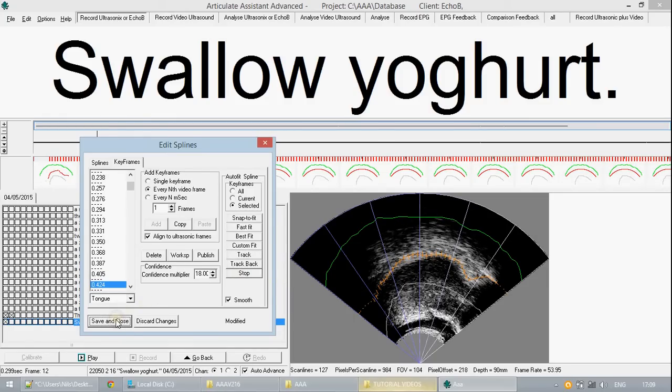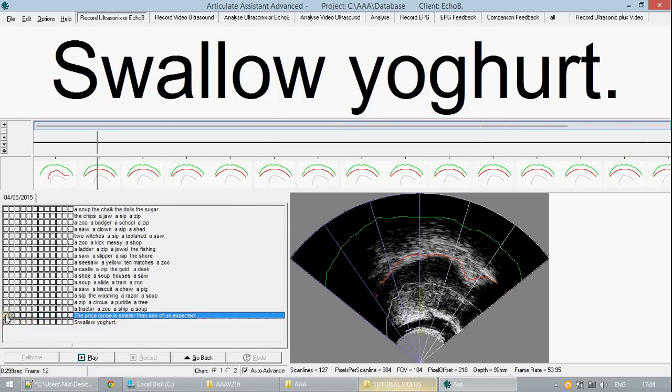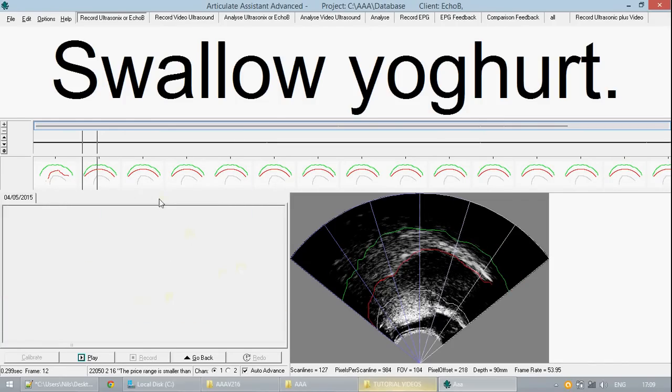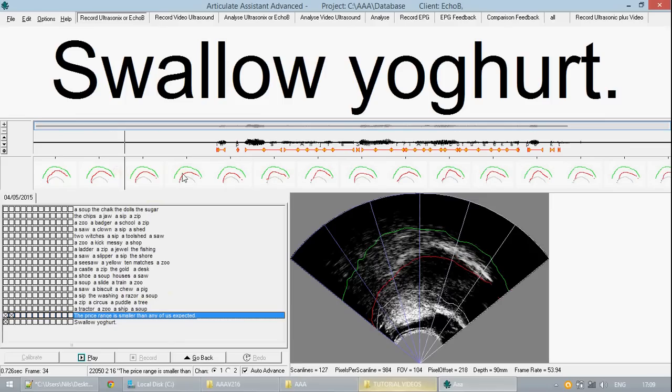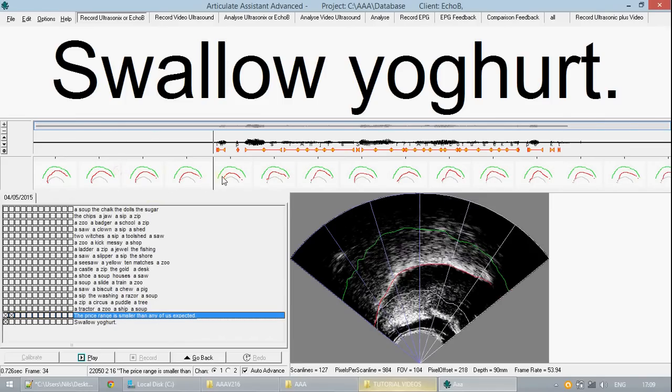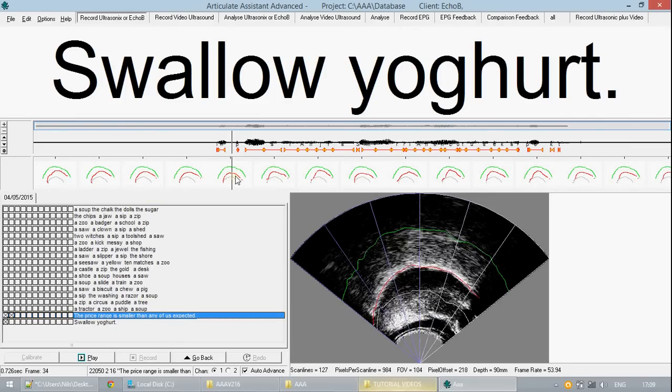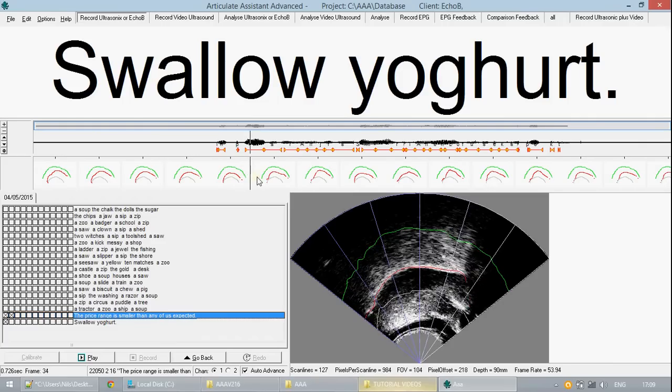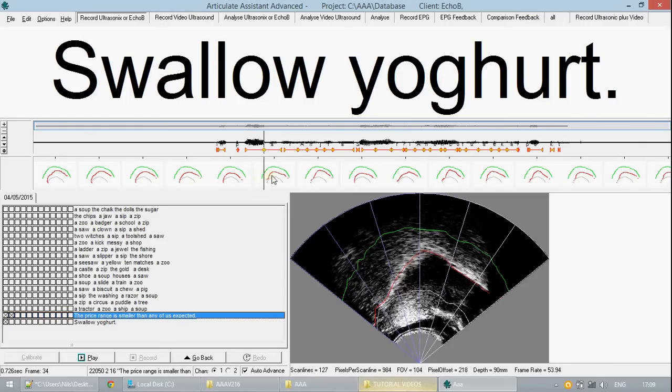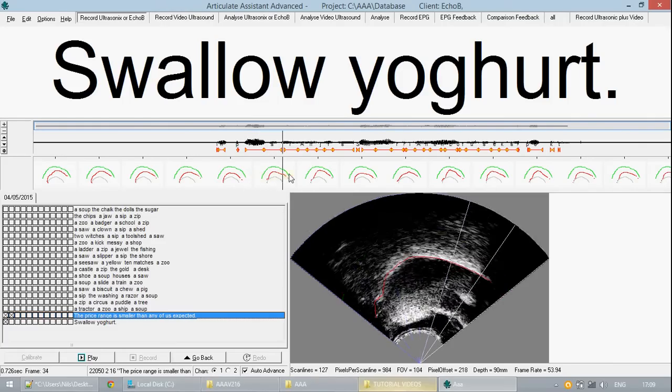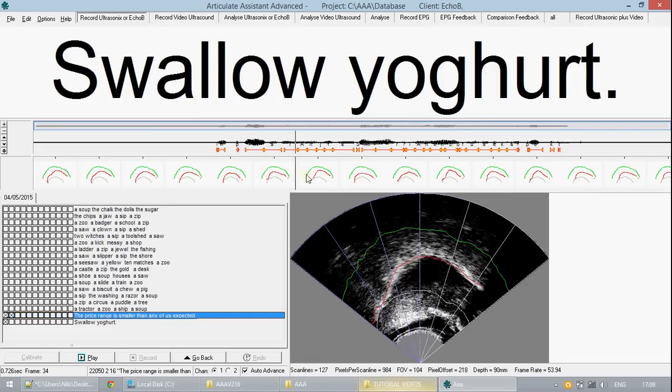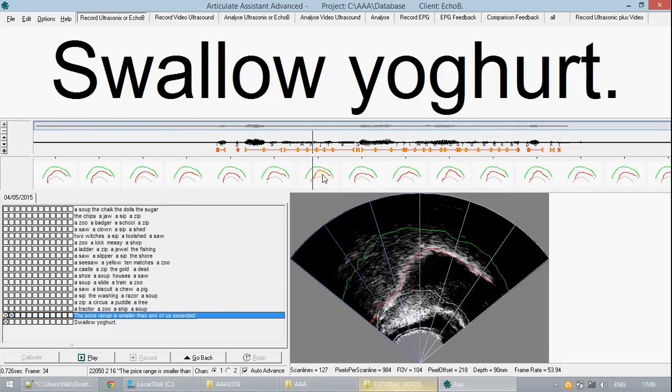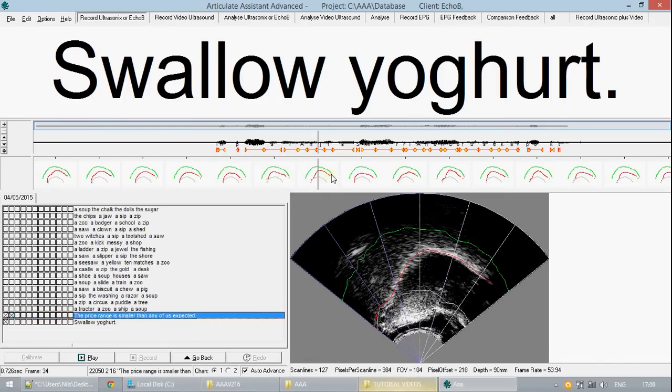Let's look at the one that I made earlier that is using the previous data from the last tutorial. If we look along the timeline here you can see the red line of the tongue spline following the outline of the sonic boundary with the tongue. You can also see how it corresponds to the annotations above.